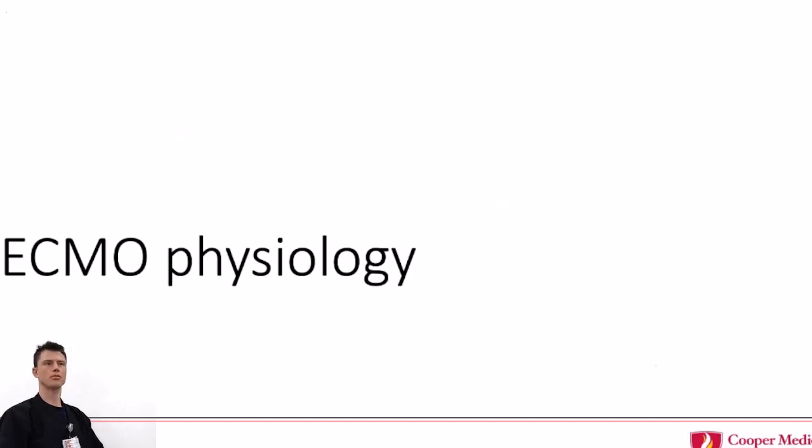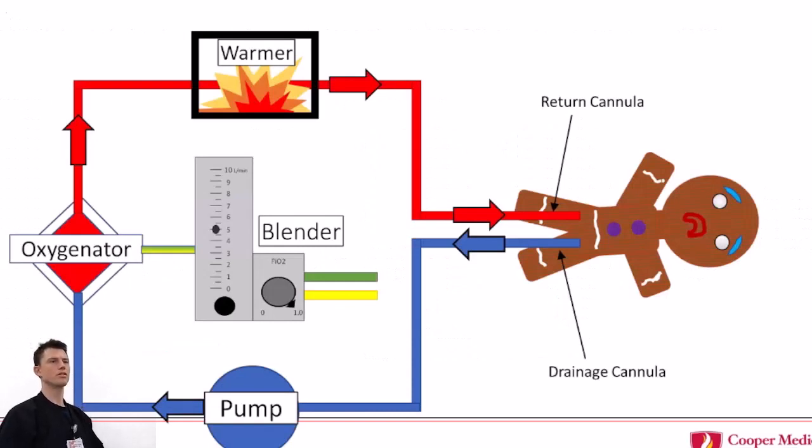And what else? Talk about other things we can change. Sweep actually won't change, as long as there is sweep there, it typically doesn't change your oxygenation, whether you go up on the sweep or come down. But there's one part of the sweep gas we can control.